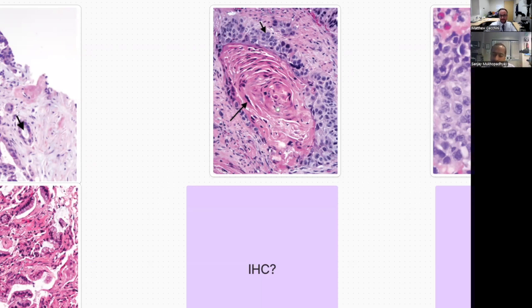So I don't do any immunostains for subtyping this, so to tell adeno versus squamous. And for the question of site of origin, there's no point of doing immunostains anyways, because all squamous have the same immunophenotype. The only exception here, Matt, is that if there's a P16/HPV positive primary in the cervix or in the oropharynx, there I think you can do it.